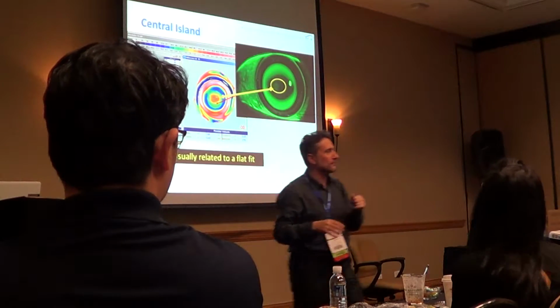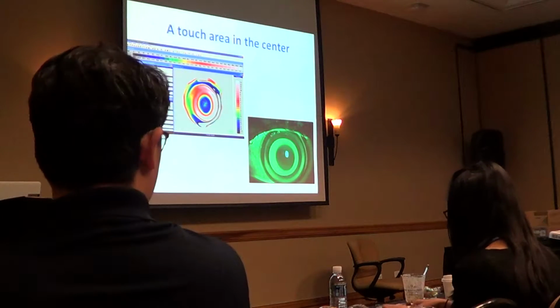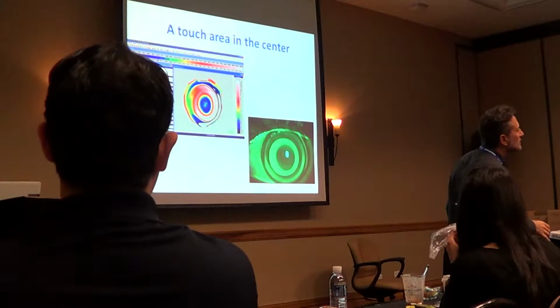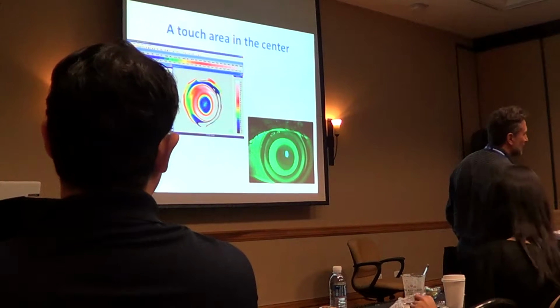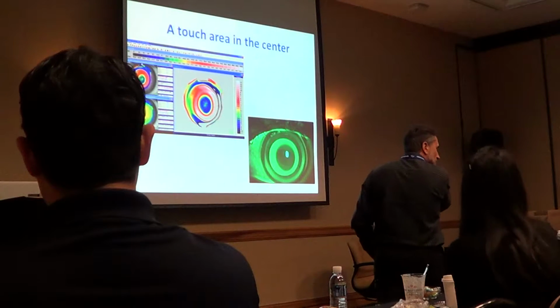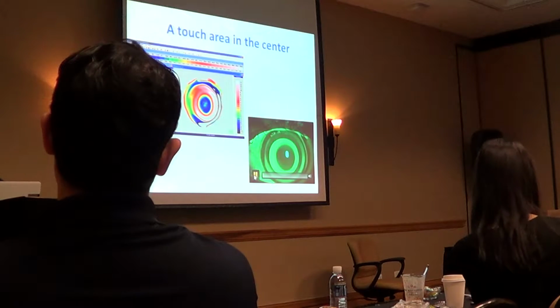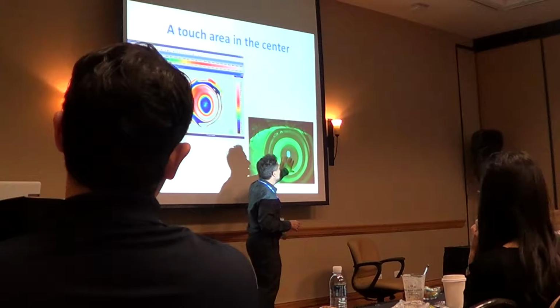Last one? Previous one? Yeah, go ahead. And that lens is tilted. Oh, yes. The lens is tilting, yes. I'm saying, you'll get different areas of touch. We talk a lot on that today. So it's again the same. The lens is moving. Okay.